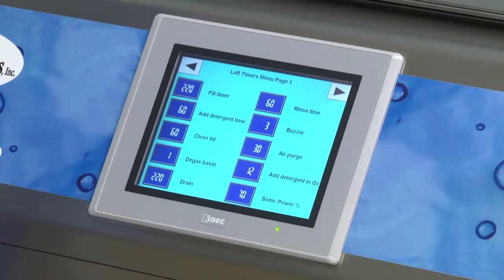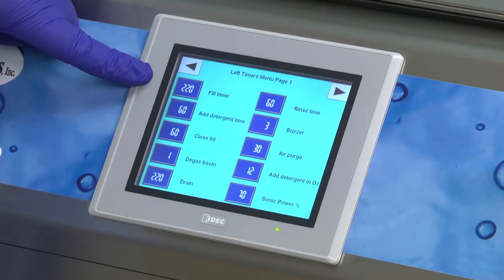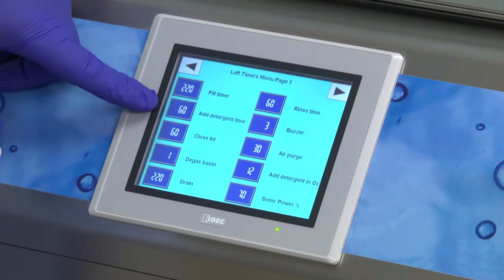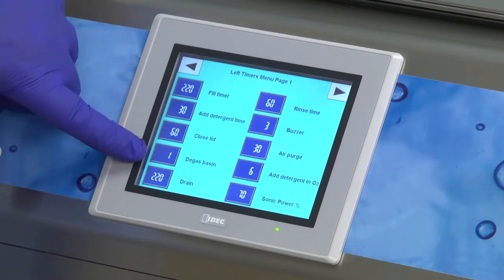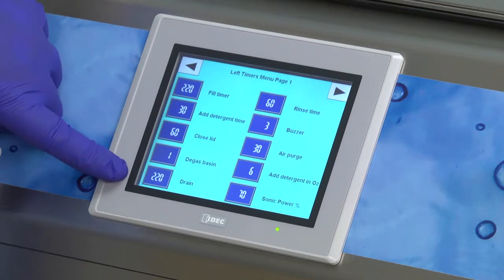In page one of the timers menu, the first option is the fill timer, which sets the duration for filling the machine with water at the beginning of a cycle. Add detergent time is preset and should not be changed. The closed lid setting determines the amount of time you have to close the lid before an alarm sounds. Degas basin is for facilities that have extremely hard water or high amounts of gas. The default is set at only one second. The drain is set at 220 seconds and should not be changed.